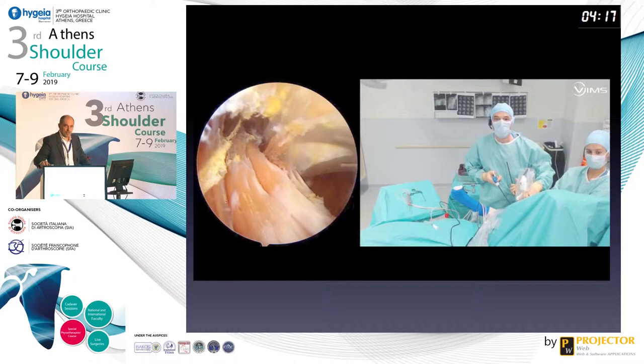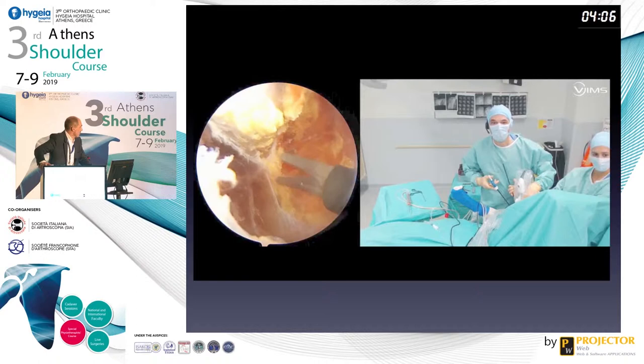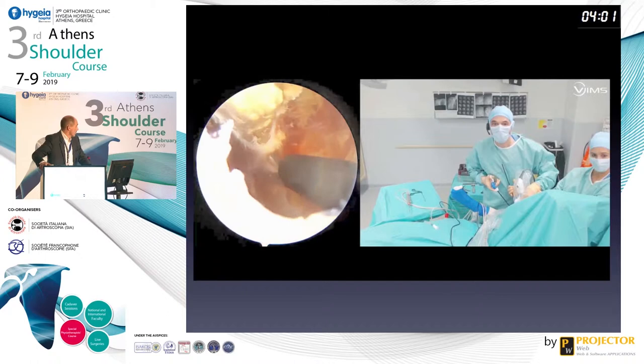Sometimes I look at it, but again, for the anterior transfer of the lat dorsi, I think it's useless to go and control it because you don't need a lot of lens to control everything. But you can see it's like microsurgery. How nice is the view? And you just make a normal surgery, but you are just in the water.